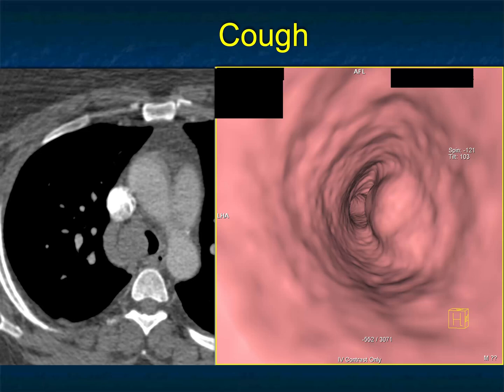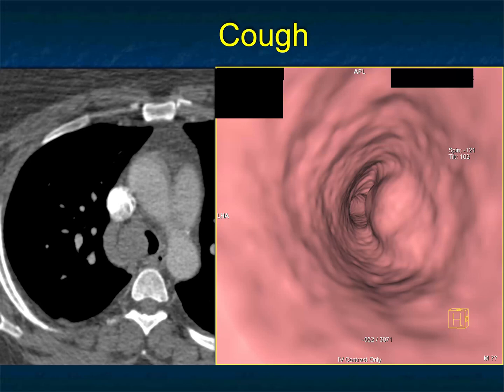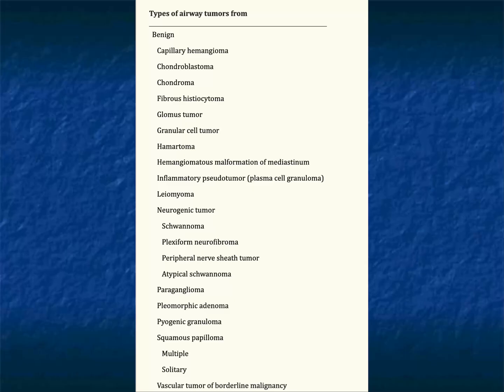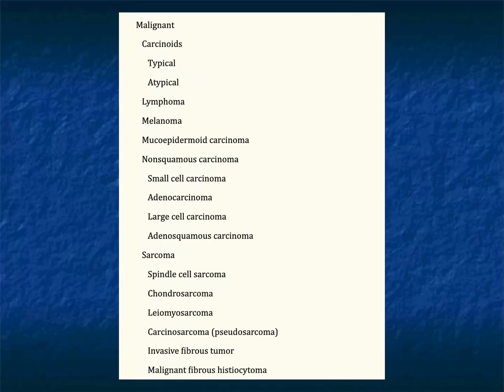Patient with a cough — what are you thinking here? I'm giving you an axial CT and then what looks like virtual colonoscopy with a big polyp, but what you're seeing is a mass in the trachea — that's an endoluminal view of the patient's mass from below. What gives you masses in the trachea? There are tumors: it could be squamous cell carcinoma, or an ACC — adenoid cystic carcinoma. Those are by far the two most common. It could be a large node pushing in, such as lymphoma. It could be benign tumors: fibromas, myxomas. It could be metastasis.